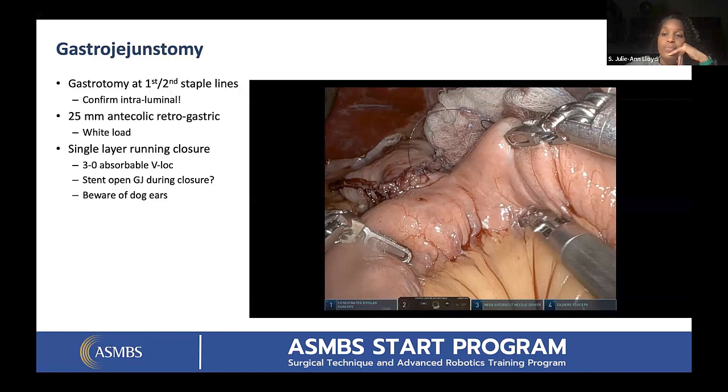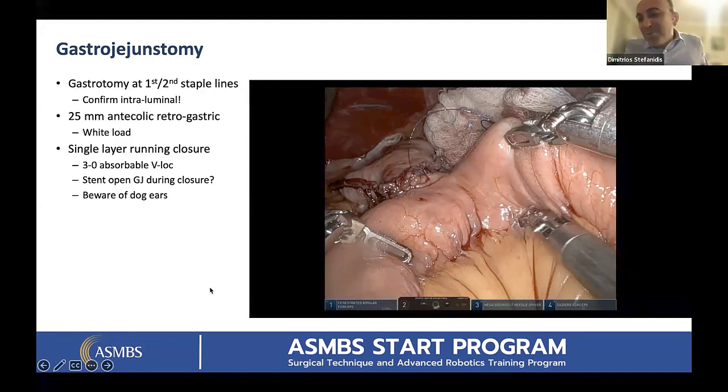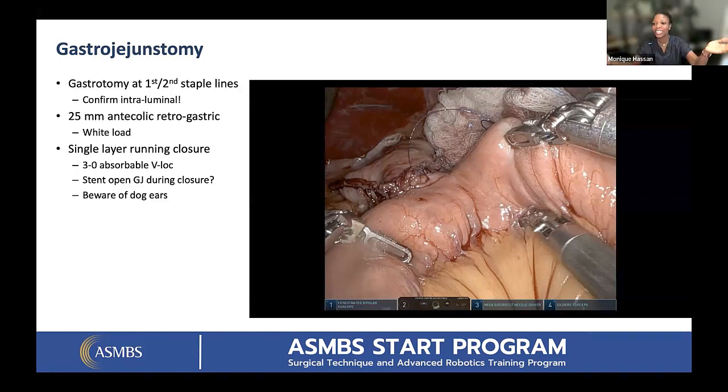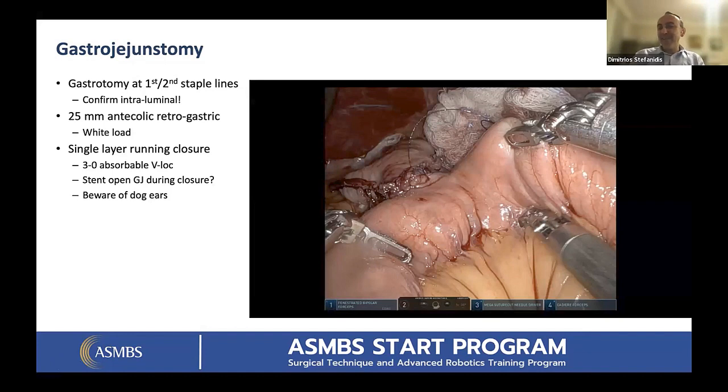So yeah, I think Demetrius needs to give us a rebuttal. Why? Yeah, so if I'm allowed to joke a little about this, I think my technique is the best, mainly because I heard people saying it tends to leak there and there, and I've never had a leak, so I don't really know where it leaks. Mine doesn't leak. Now you jinxed yourself. No, he only has staple line infections, no leaks. Staple line infections. But I really don't know where it leaks because I haven't seen it leak.